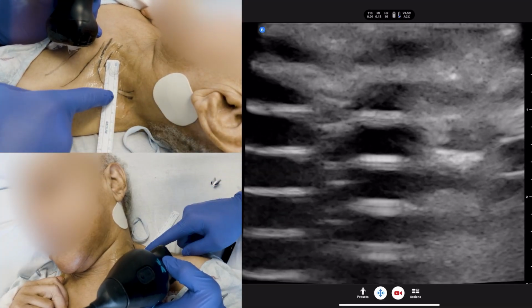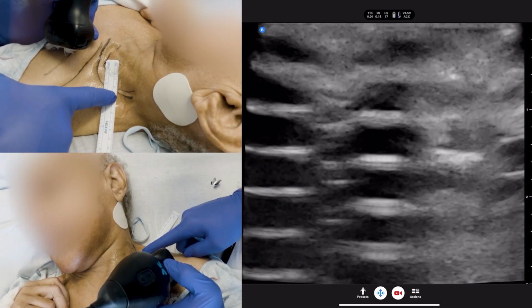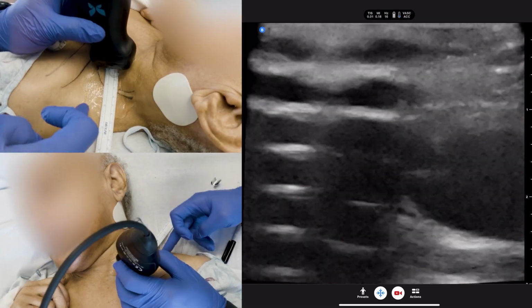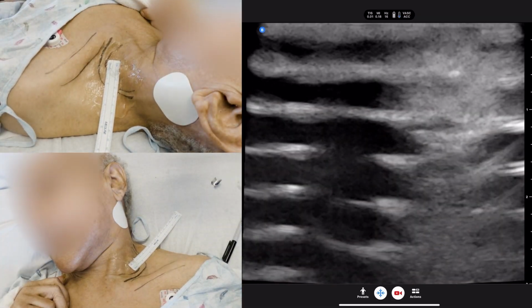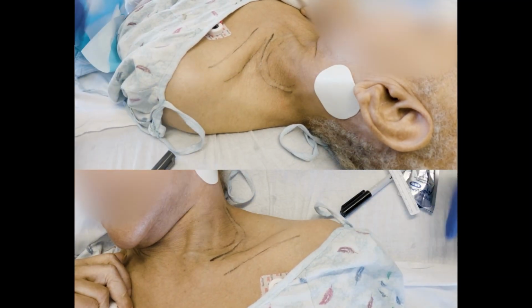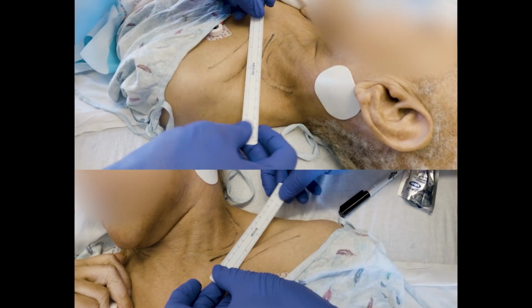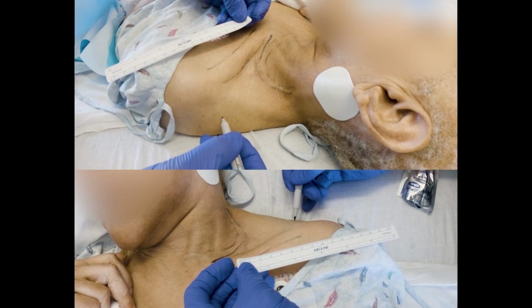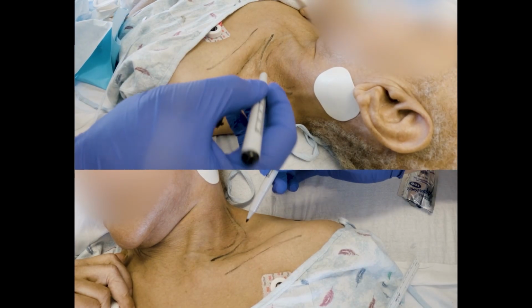So that's about, that's gross, about from the 4.5 to 5 centimeters where I'm going to enter, and then we're going to enter into here. And then we'll remeasure for the subcutaneous tracking afterwards. Yeah, I'm going to put a wedge under her to give me more room to needle that tunnel. But let's take a look at what our anatomical measurements are going to be. So if I'm going to try to end here, and then we'll remark that after we clean it.